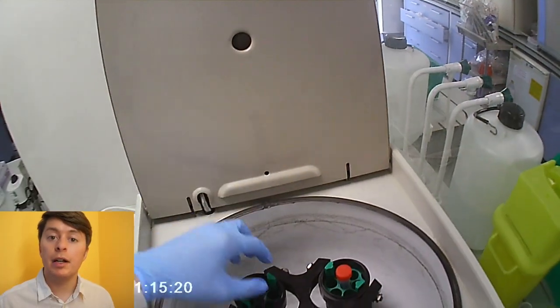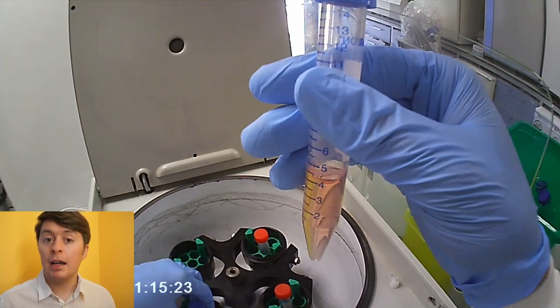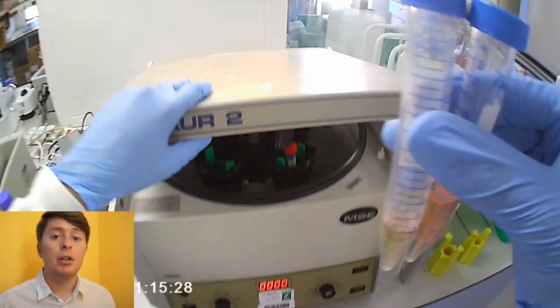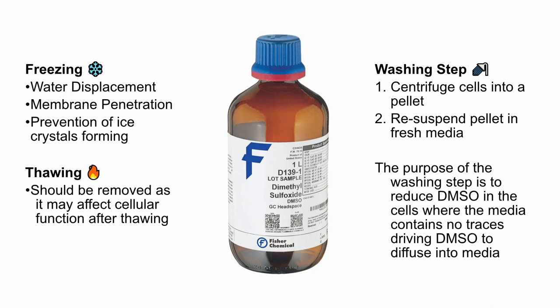So I was thawing them by sticking them into the heated water bath and quickly transferring them to a Falcon tube, centrifuging them down to create this pellet to then wash the media over the top. And the reason we want to do this so fast is because when we freeze our Jurkat T-cells, we use something called DMSO, which is dimethyl sulfoxide. This is a great agent when we're freezing because of its membrane penetration and water displacement properties. This means that it reduces ice formation and thereby prevents cell death during the freezing process.